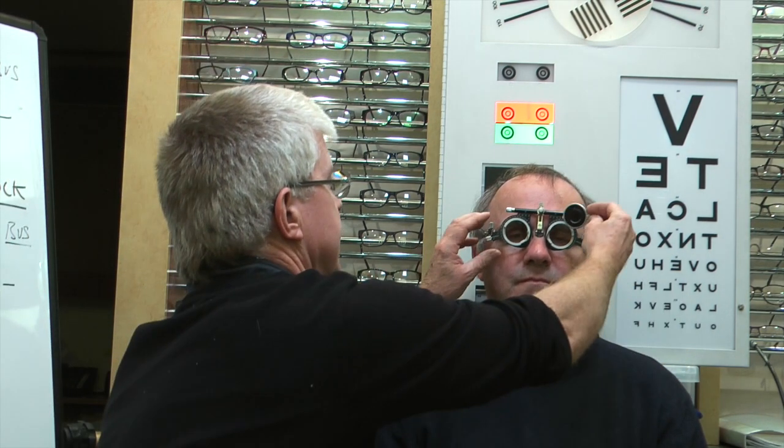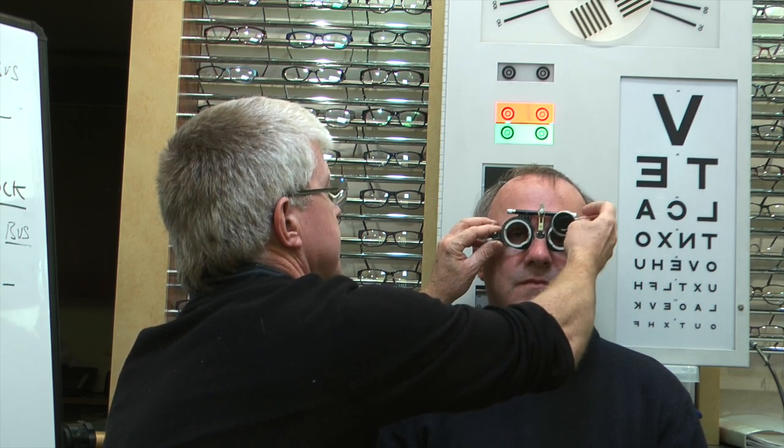We've done the right eye and found it to be minus 3.25, so we're going to now do the same for the left. We occlude the right lens now and we're going to put the Snellen chart on again. I'll come to the duochrome a bit later on. So now without any lenses in the trial frame, Alan, can you tell me how far down the chart you can see?